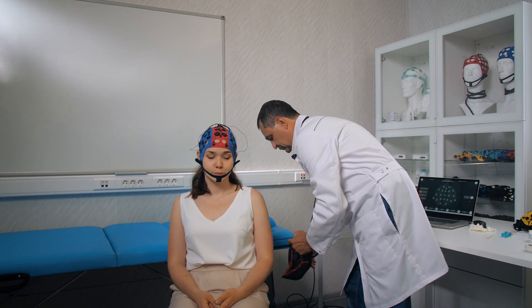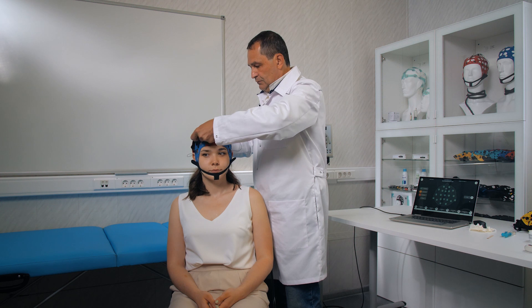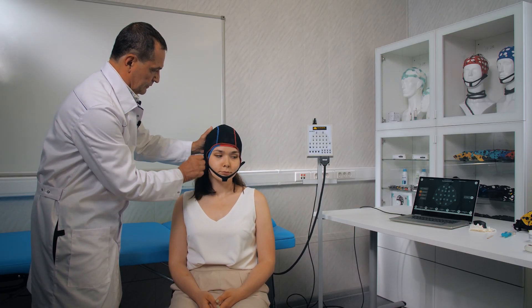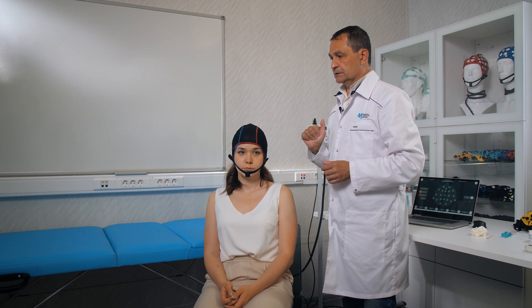Afterward, we ensure everything is secured by utilizing a special mesh. We have confirmed that the impedance is acceptable. We fixed the cap with electrodes by adding an extra mesh, and now we are ready to place our model on a special couch designed specifically for this purpose. Everything is in place and we are fully prepared for the next steps. In actual circumstances, this ill individual will be confined to bed, and subsequently the electroencephalogram monitoring commences for numerous hours, for the duration required.